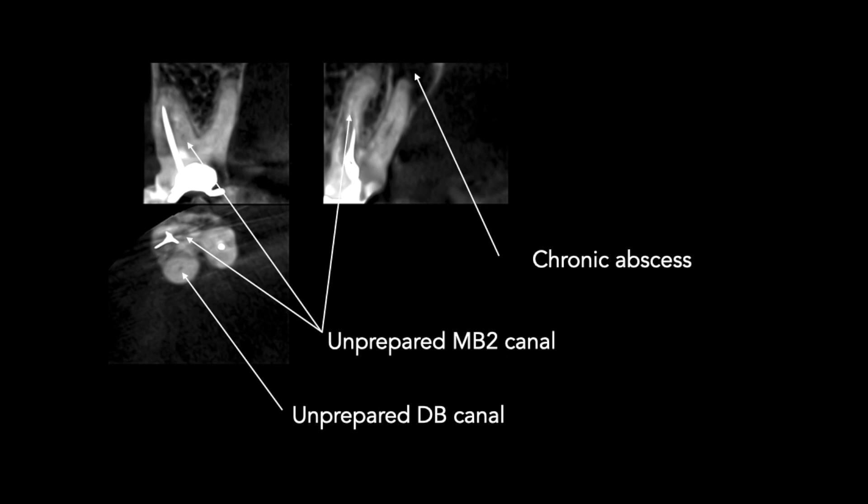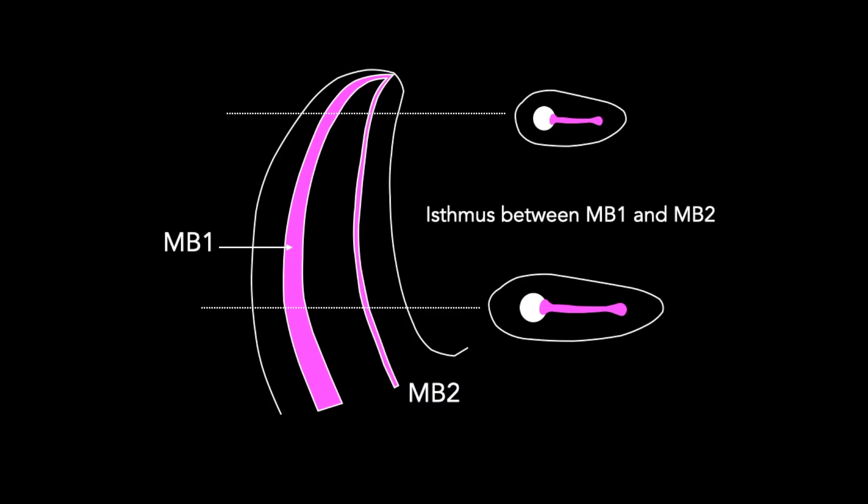There's also a missed MB2. We can utilize the missed MB2 to help retrieve the silver cone. There's going to be an isthmus between the two canals and we can work laterally towards the silver point.